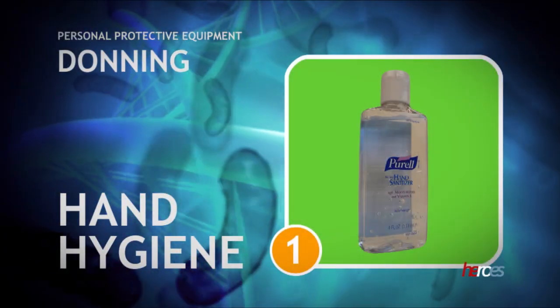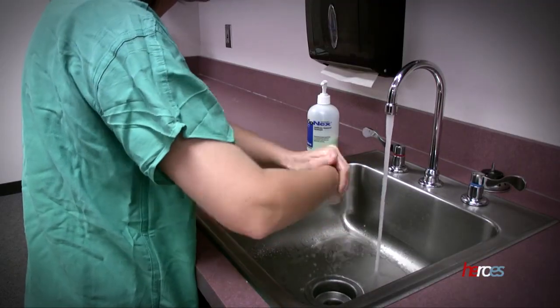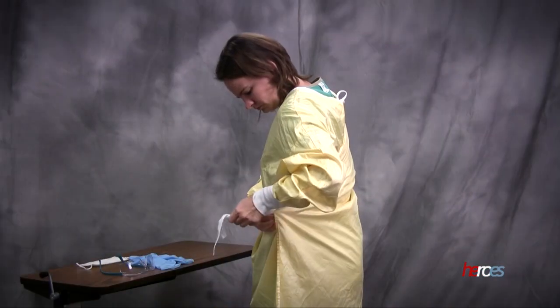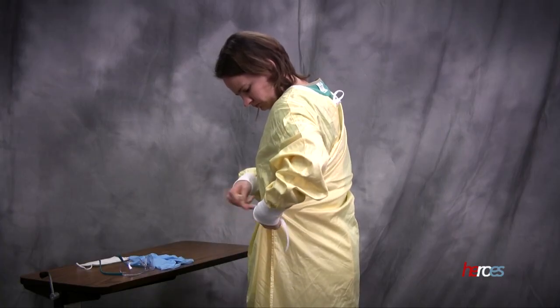The first step in donning personal protective equipment is good hand hygiene. The second step of the procedure is donning the gown. The gown should be fastened at the back of the neck and the waist by tying a bow.